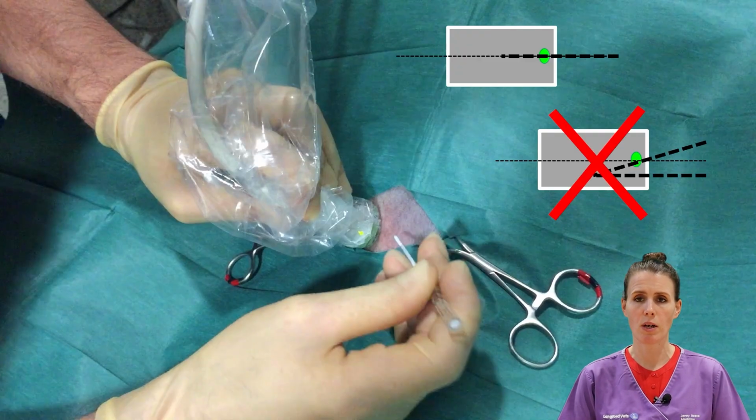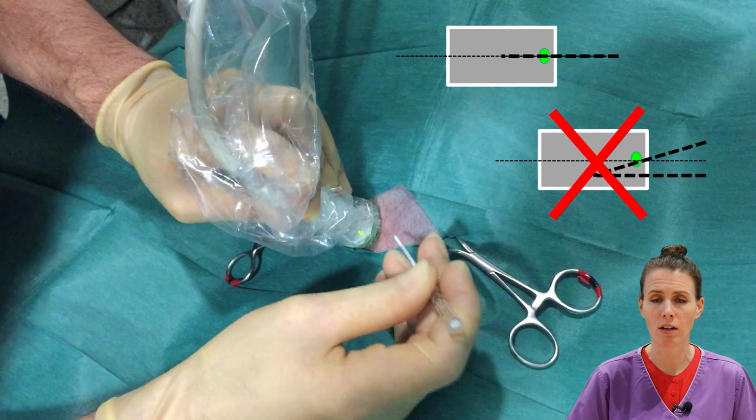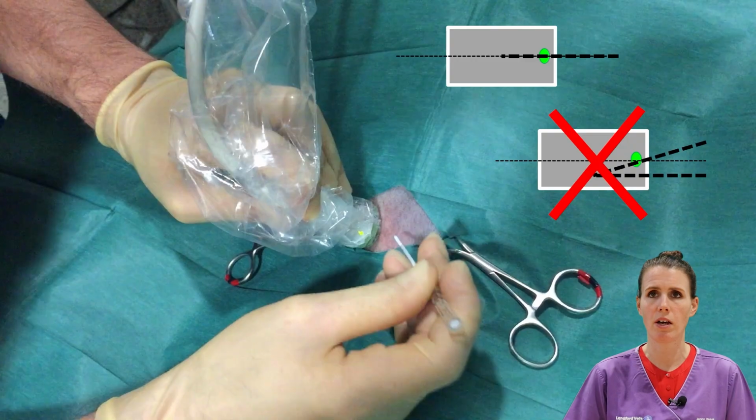So revisiting whether we've lined everything up appropriately, and if we need to, just gently moving the ultrasound probe to try and identify our needle, or if appropriate, reinserting the needle, will hopefully enable us to locate our needle.